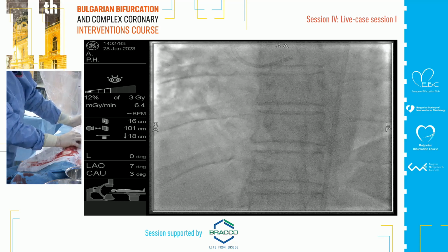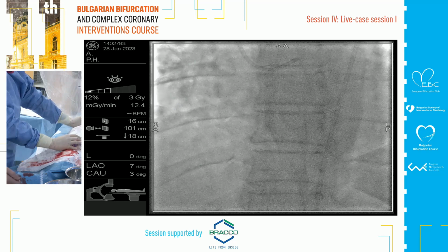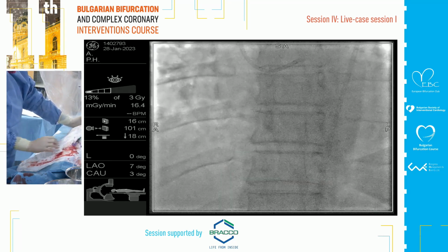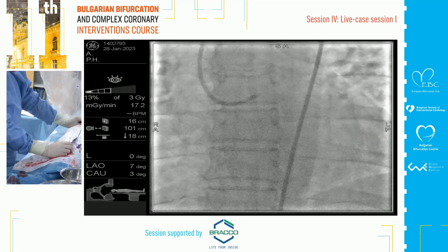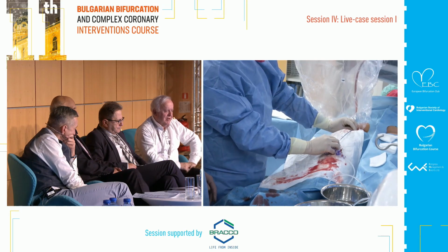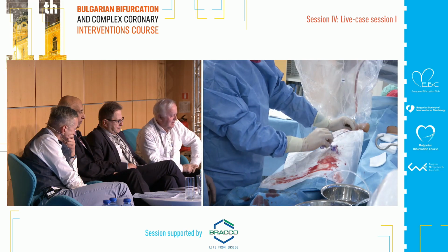Like yesterday you had a case of... We will move one minute to the other cath lab, Gianluca, just to see what they have found at coronary angiography. All right. So we are back soon. Okay.